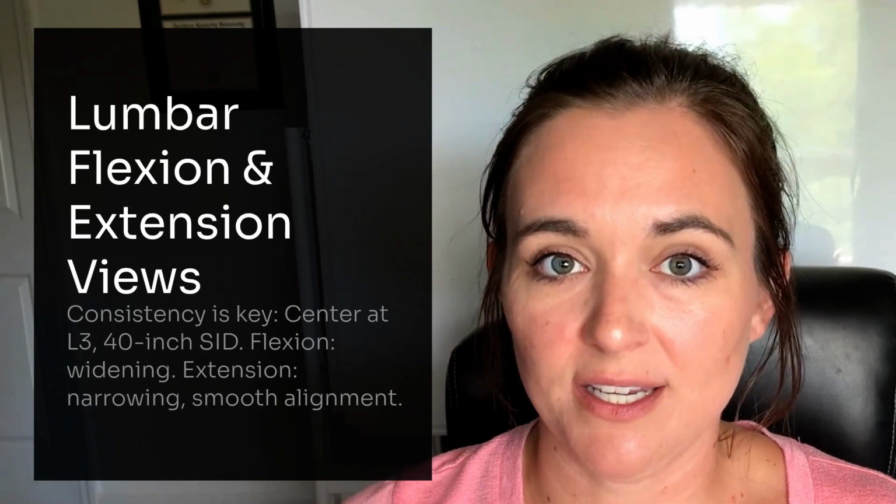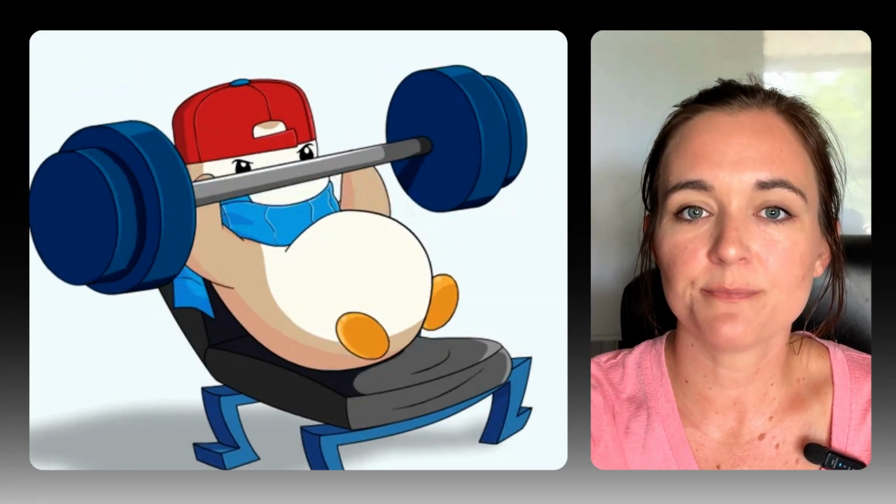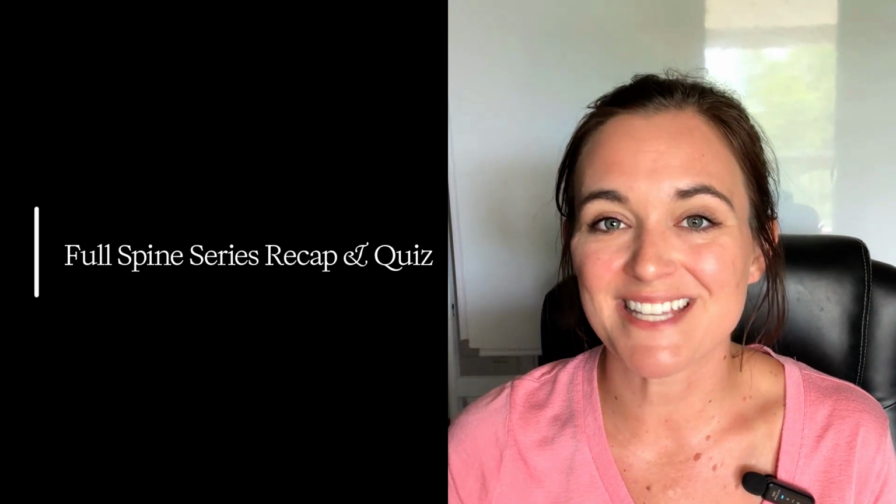Flexion should show widening, extension should show narrowing, but both should keep a smooth, continuous alignment. These might not be everyday images, but when you can get them, they carry serious weight. Coming up next, we're wrapping up the full spine series with a final review and quiz, so stay with me.